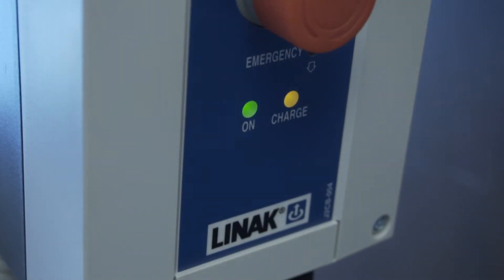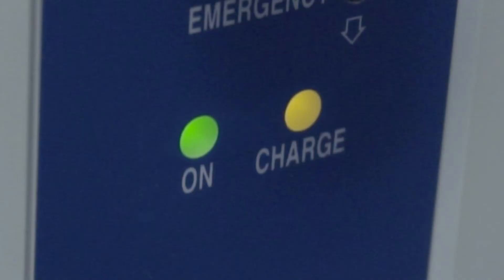Two lights will illuminate on the control box: a green on light, which indicates the charger is plugged into the wall, and a yellow charge light, which indicates the system is charging.